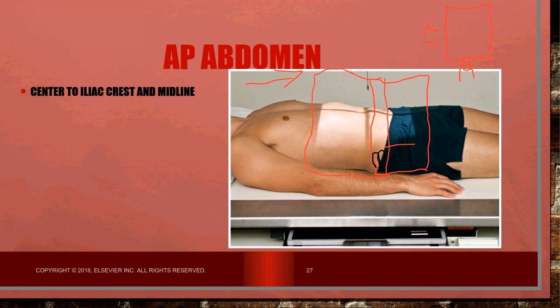Okay, so this is your second image, and what that means is all of this in between is overlap, meaning this was the top of your first image and the bottom of your second image. So all of this is overlap.